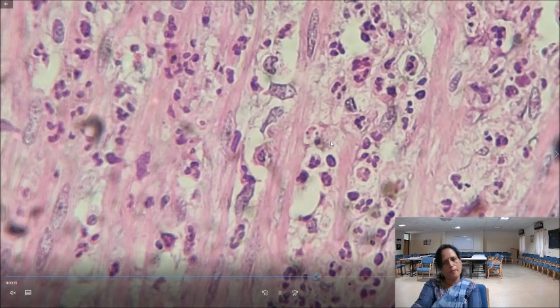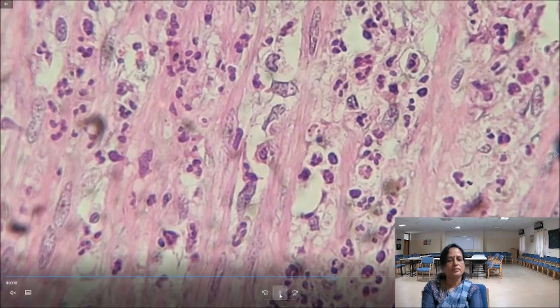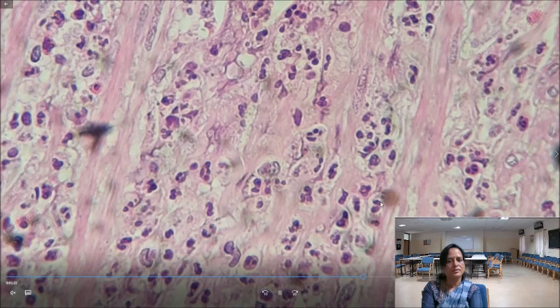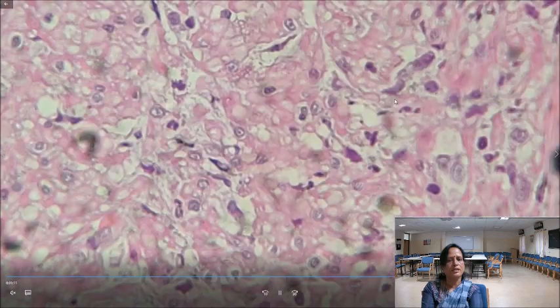The images are very clear. See a higher magnification. You can make out 3 lobes here, 3 lobes, 3 lobes, 3 lobes. You know, we should be able to identify how a neutrophil looks in tissue sections. See, plenty of neutrophils wherever we are seeing. All these are neutrophils. While writing a diagram, you have to depict all this.